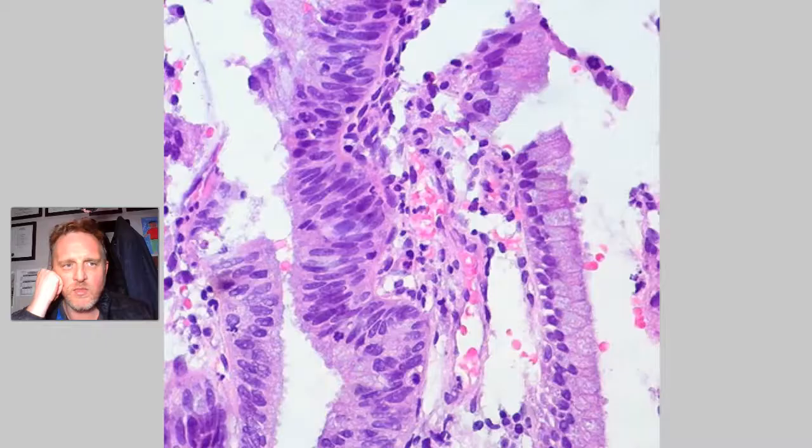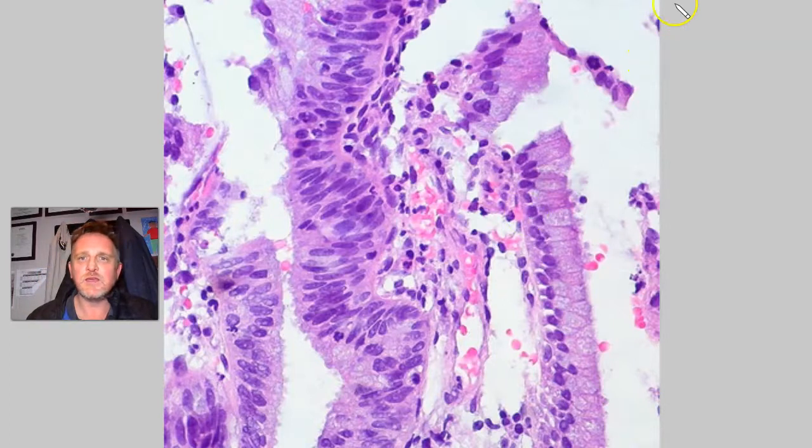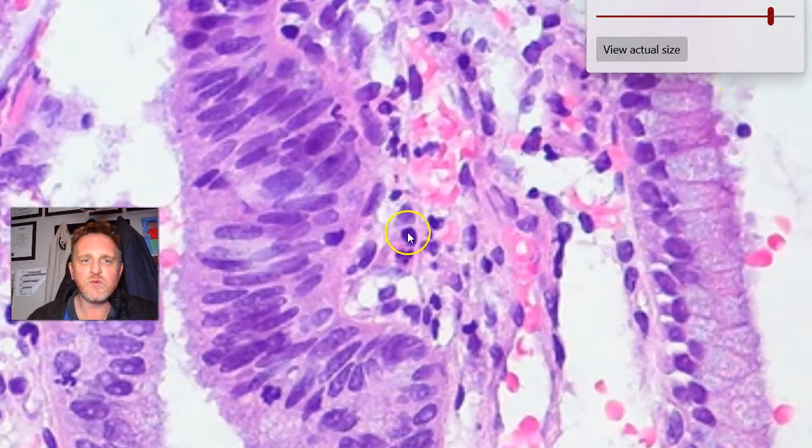Just incredible. Okay guys, so here we have a typical standard routine stain. This is the hematoxylin and eosin stain, and you can see that the nucleus comes up a beautiful purple, and variations thereof. The lighter staining, less nuclear or chromatin material, that being a case in point, or there. And the darker the nucleus, the more dense the chromatin is. And this just reflects the different stages of nuclear activity.